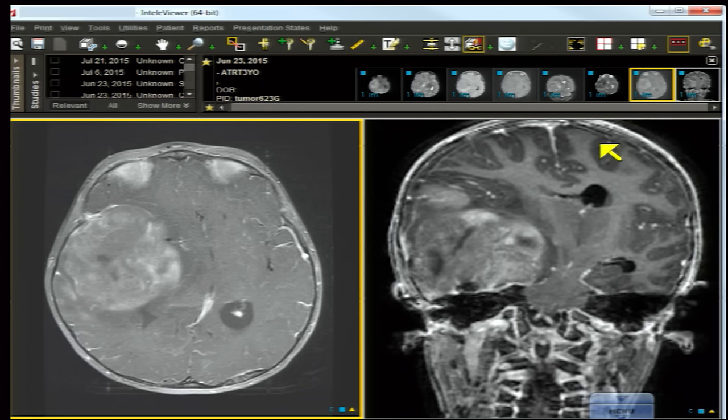Pilocytic astrocytoma more frequently presents as a large cystic mass — a single loculated cyst with an enhancing nodule — and occurs at ages 5 to 15, as opposed to less than three years. Another uncommon consideration is pylomyxoid astrocytoma, which is found in infants like this patient, is solid, and enhances, but the location in the hypothalamus and chiasm is quite different.